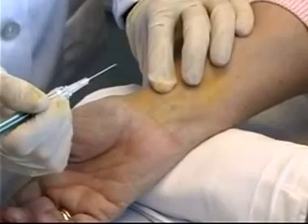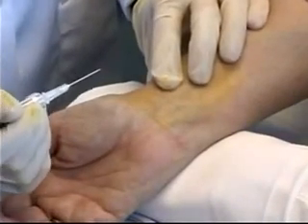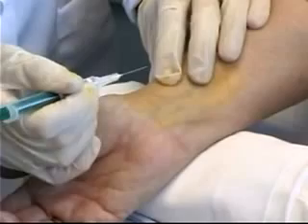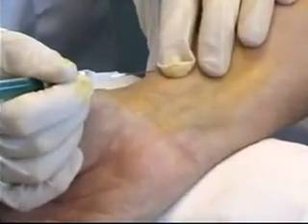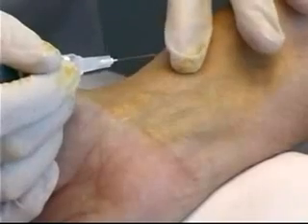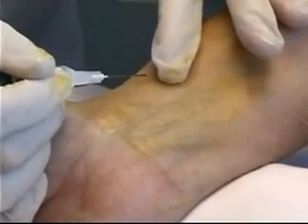Feel for the pulse — that is truly the only landmark for knowing where to break the skin with the needle. With the needle right there and ready, once confident you are in the right area, roll your finger back slightly out of the way before inserting the needle into the skin.